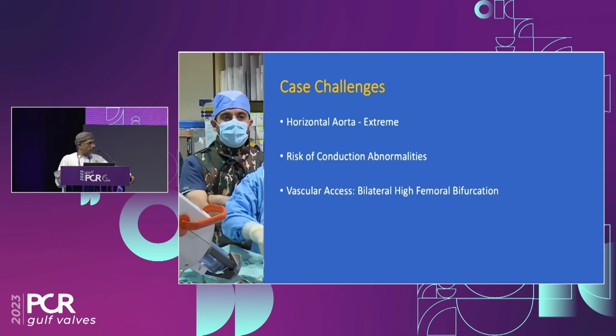So I need to hear from Dr. Fadi and Dr. Wael, what are their comments about the case? Yeah, it's a very challenging case. You have many things to overcome.